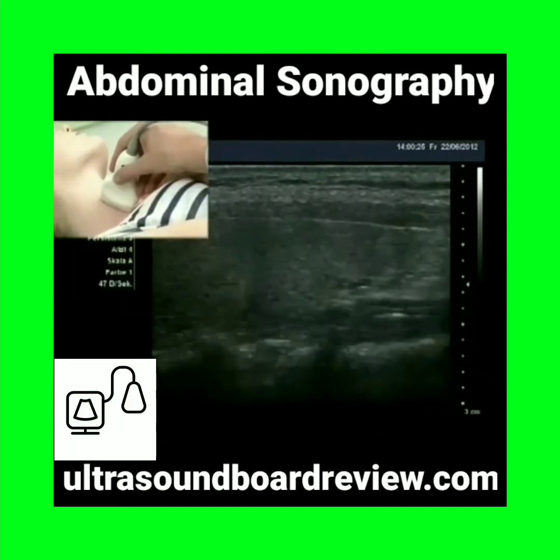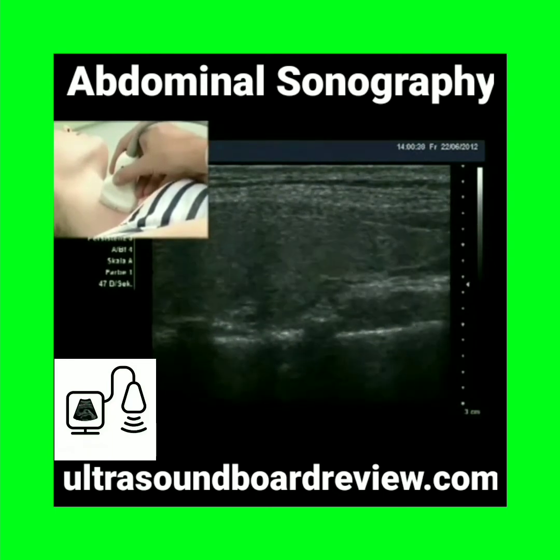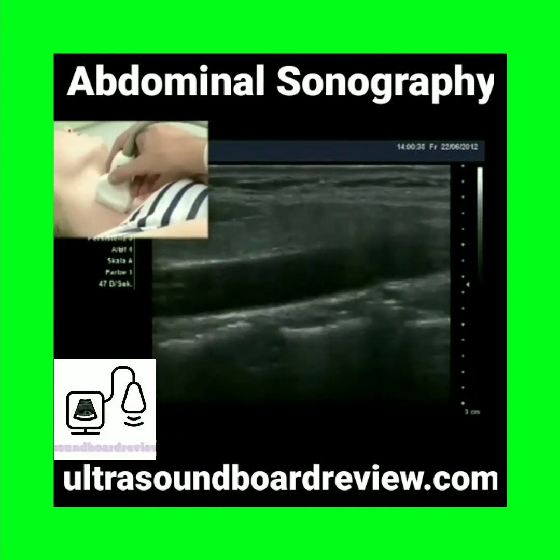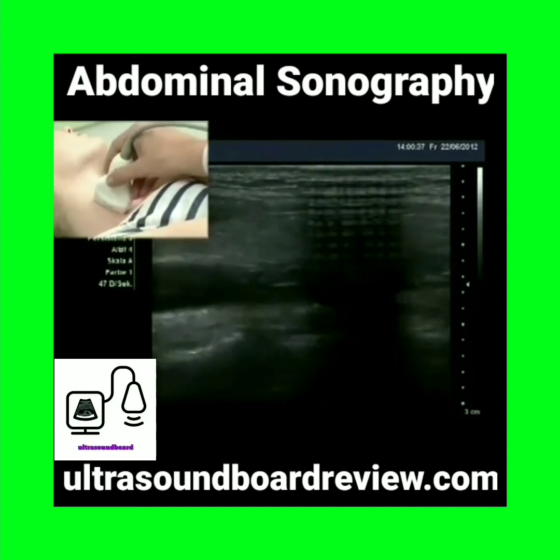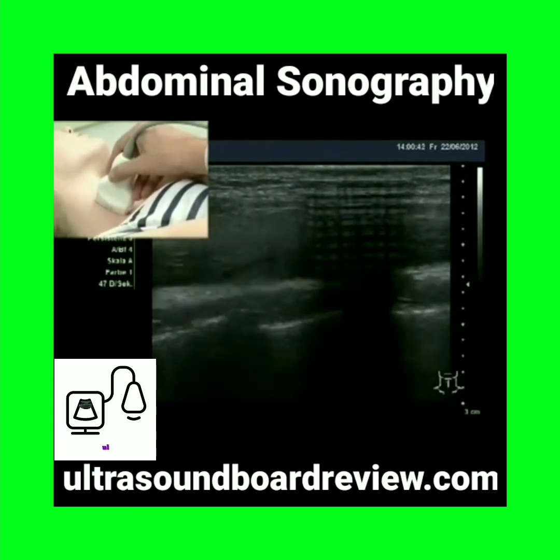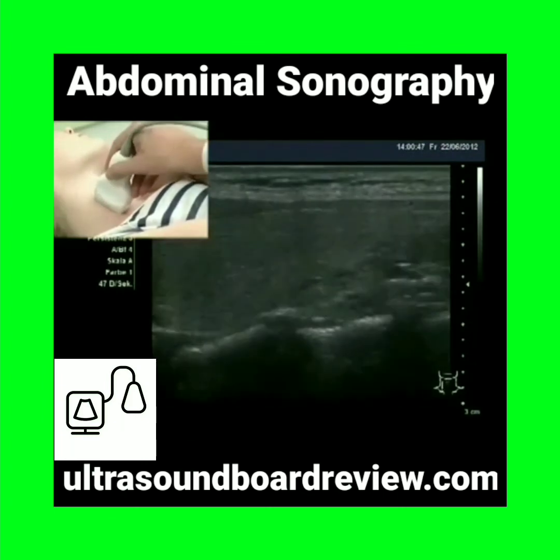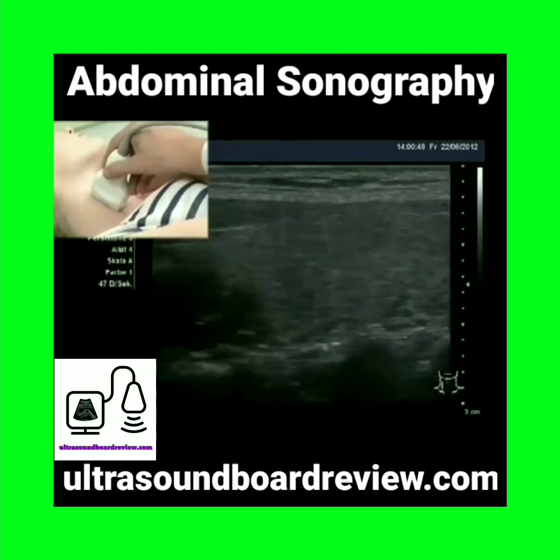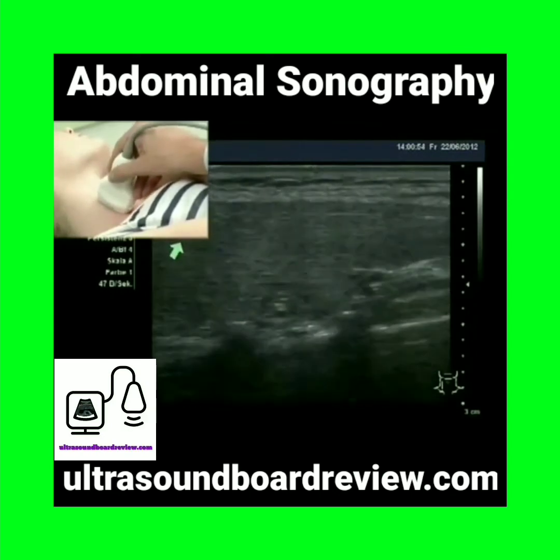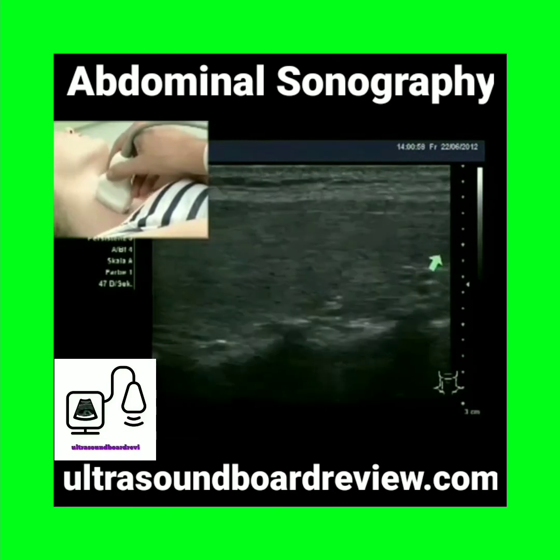For the measurement of the volume of both thyroid lobes, we are looking for the longest craniocaudal distance of the lobe. Check the upper pole and the position or ending of the lower pole.